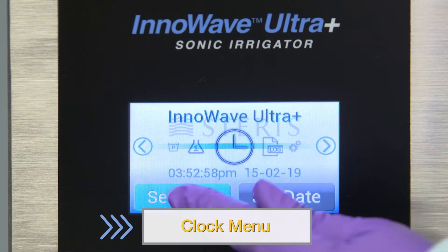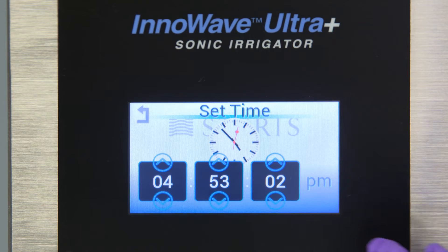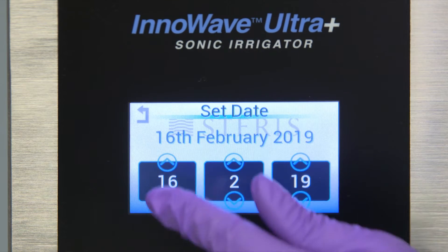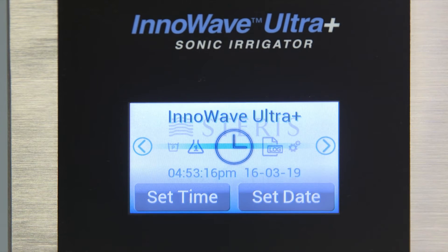Use the Clock menu to set the time and date. Simply select the parameter you wish to change and use the arrow keys to change the values. Then press the back arrow in the top left corner to return to the main menu. This unit also tracks the important parameters of the ultrasonic cycle.